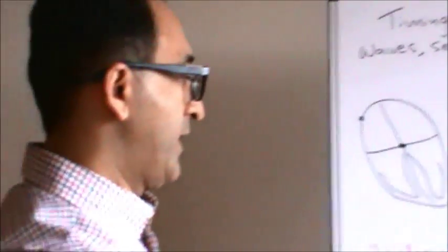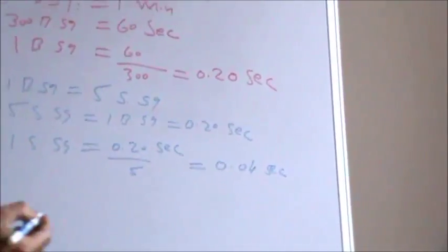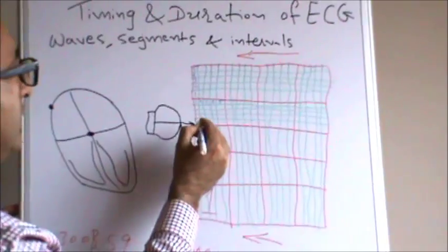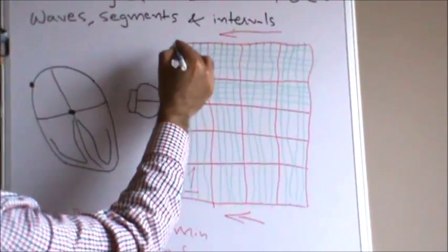Okay, if you want to succeed in your life underwriting career, this 0.04 second, that means, let me draw it here, that means this much.